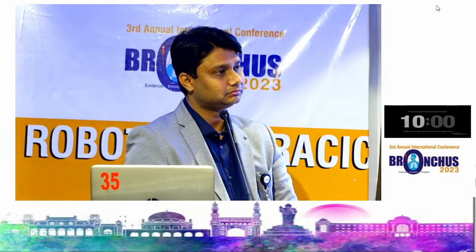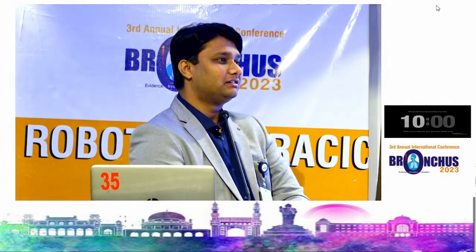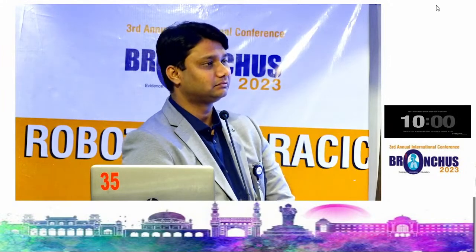Just to go through the various surgeries we have seen today, the first thing we do is to divide the inferior pulmonary ligament. Yes, that was done at the last step here. I'm not commenting. I just want the opinion of the experts, because you're all experts here doing these surgeries.